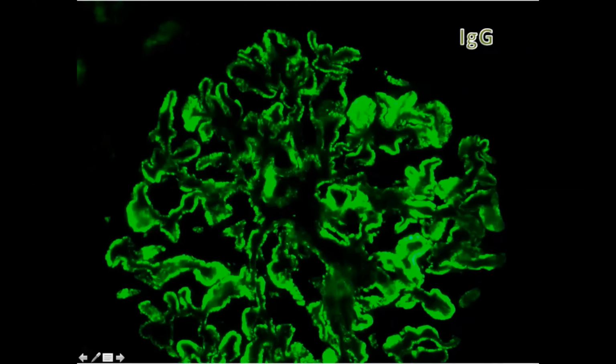When we talk about IF, we have to talk about the location, which is in the loops; the pattern, which is granular, as opposed to pseudolinear or linear; and the intensity, which is very high, probably 3 to 4 out of 4. This is the IgG. In this case we had some IgG, some C3, and both kappa and lambda with no monoclonality.